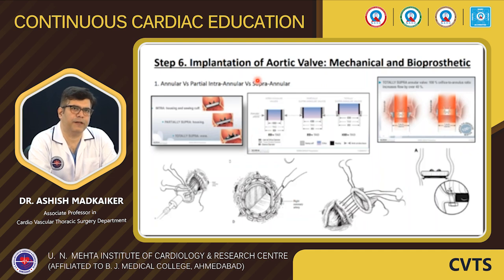One of the most important things is to decide where we are going to place this aortic valve. This figure is taken from a product monograph of Sorin. Just to highlight this point, in this slide we can see three different positions of the aortic valve. The first shows the intraannular positioning of the aortic valve. The second is partial supraannular, and the third is complete supraannular. Now why this is important will be clear from this figure.